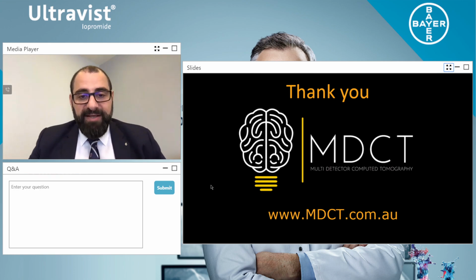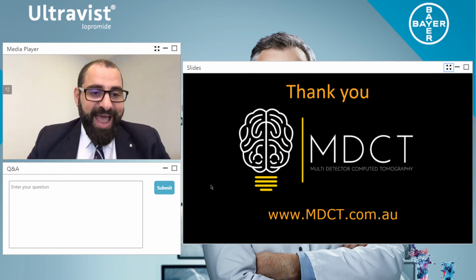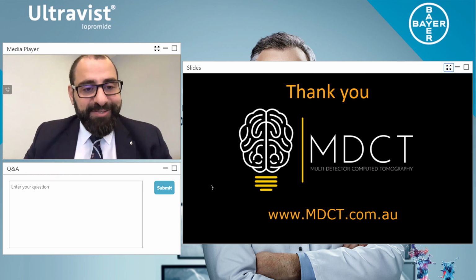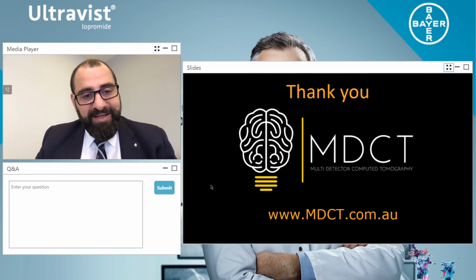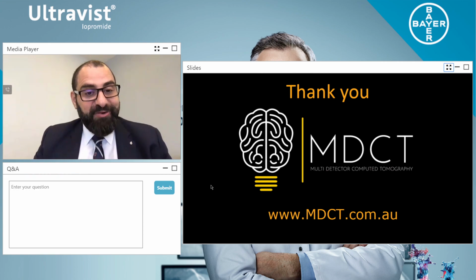Pranav Malaya: Is there a different ideal delay time between cirrhotic and non-cirrhotic? Absolutely. That's why with the 8 seconds, I take into account hepatitis and cirrhotic liver. So by adding an extra 2 seconds, we get good filling. So that's why 8 seconds into scan delay is good.